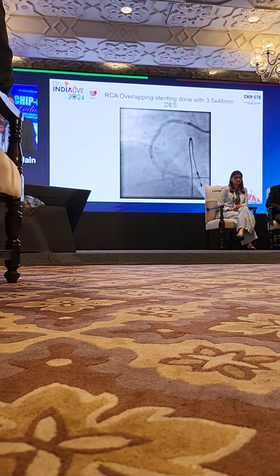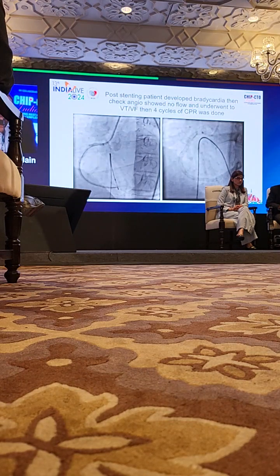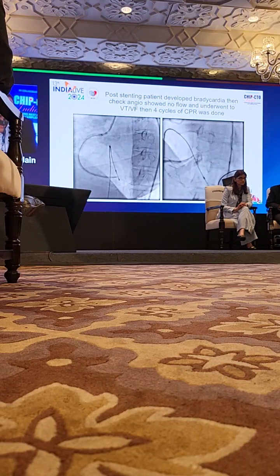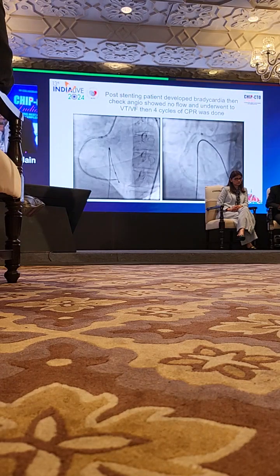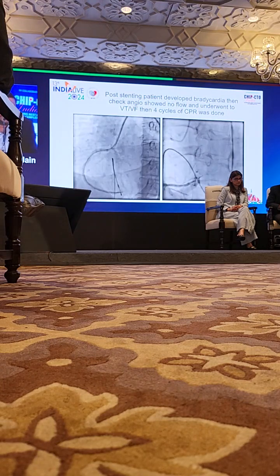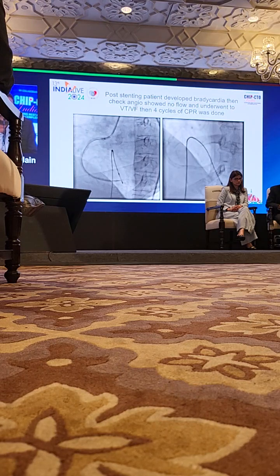The pressures went down to almost 20 and the patient became unresponsive. A blue code was announced and we started CPR. Multiple shocks were given because the patient went into VT and VF. When I gave an angiogram, I noticed there was no reflow phenomenon. I thought that because of the extensive calcium modification with the various balloons, there was calcium embolization causing microvascular obstruction.